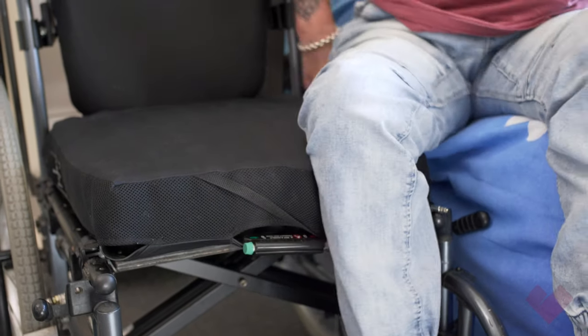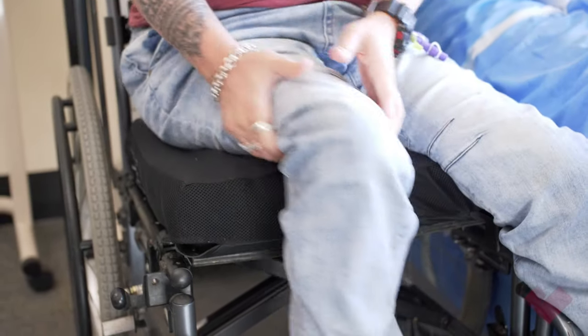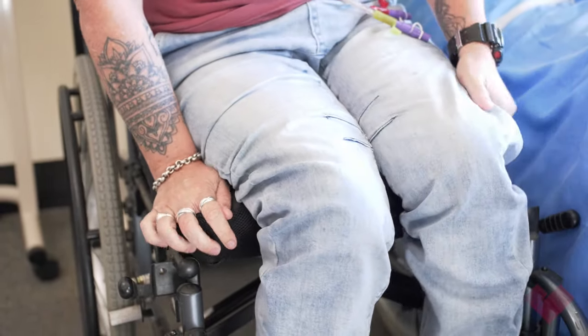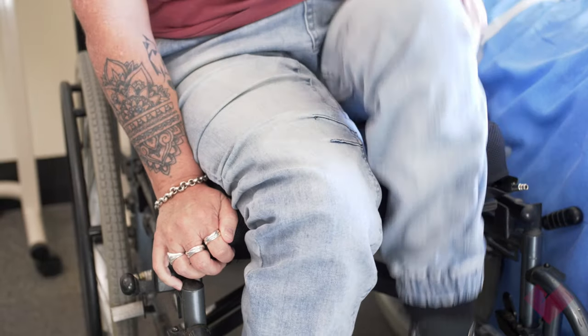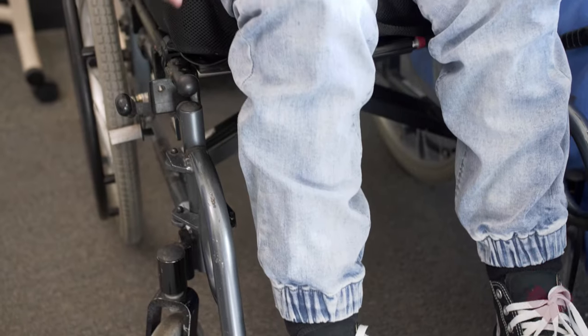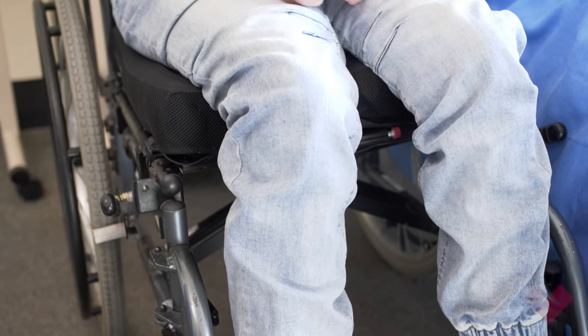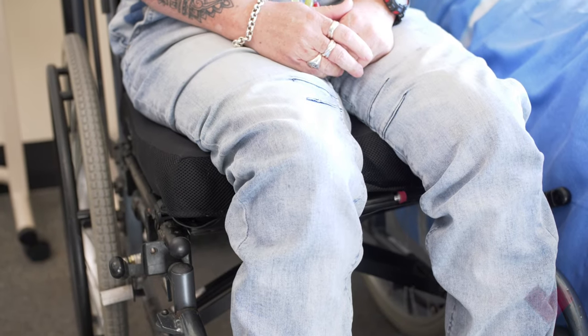Transfer the person so they are sitting on the inflated cushion in their wheelchair. It is important to make sure the person is sitting as they normally would, with correct posture and their feet correctly placed on the foot plates. The person then has to sit here for a few minutes to allow the air to settle.